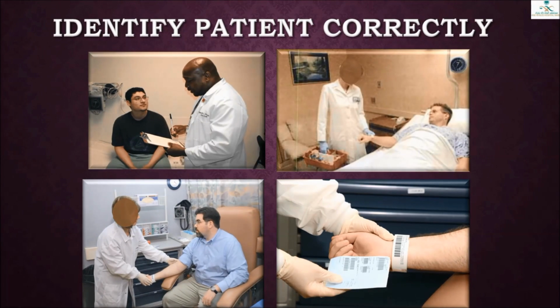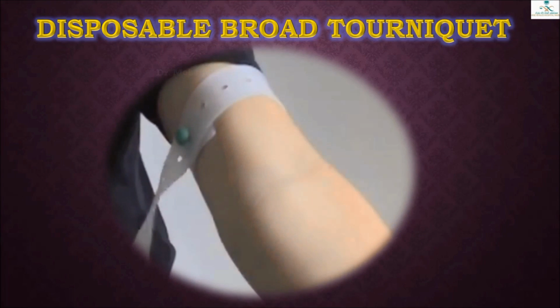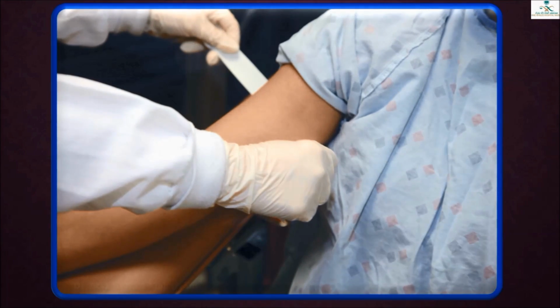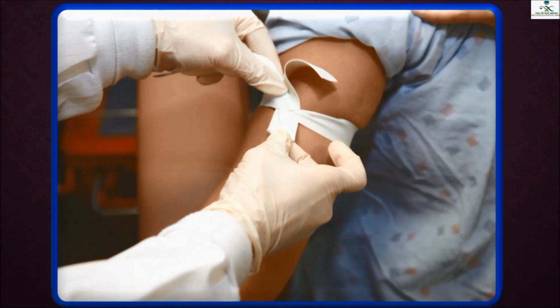Identify the patient correctly. Remember that this is the most important step. Use a broad tourniquet. It's better to use a disposable one. Apply the tourniquet properly in a way that allows easy removal.